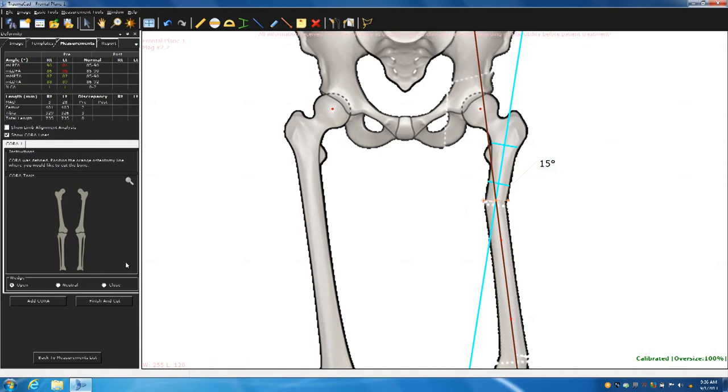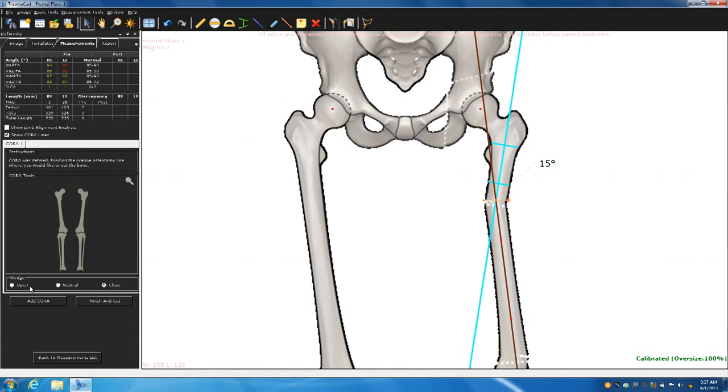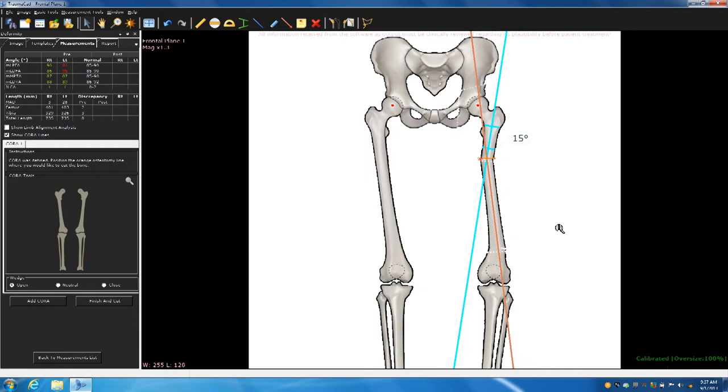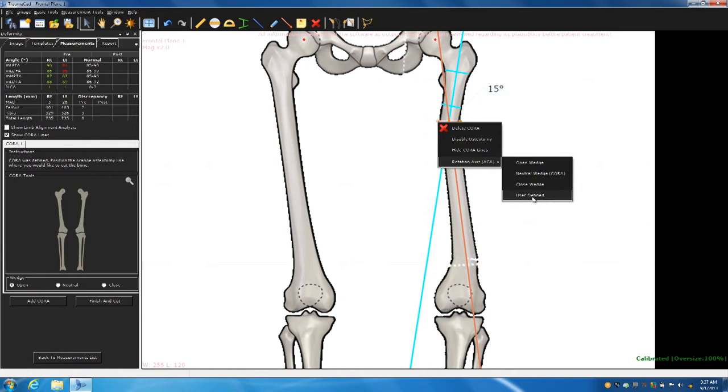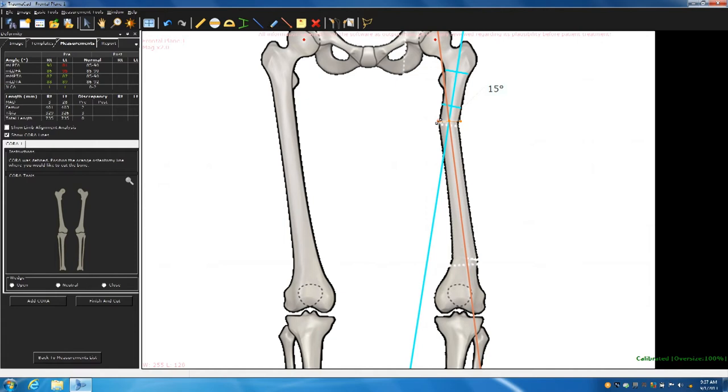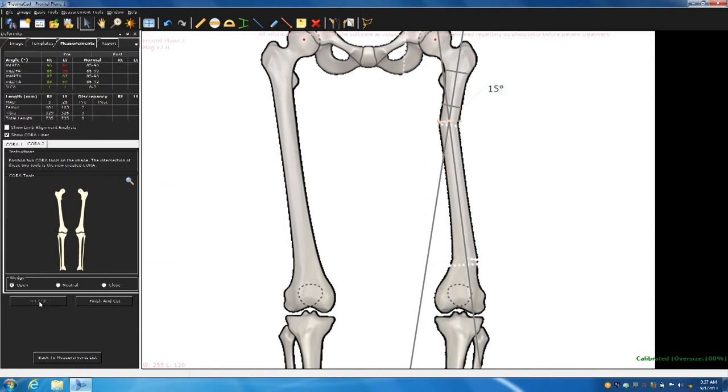You can go backwards. I want to recreate. I need a middle segment. To do the middle segment in a workbook, you just draw another line. In this program, you have to go back a step, get rid of your distal axis. You come up here to the undo button, and you will click it a couple times and wait until that goes away. And now choose your distal femoral axis for your proximal deformity. That's going to be in the middle of the bone. So you can choose a midline finder or a simple line. I'm going to choose a simple line. And then I'm going to adjust this line to be an anatomic axis in the middle segment. I'll zoom in. As you notice, as soon as your two lines cross, it creates an apex. It gives you a magnitude. It gives you an osteotomy site at the apex, which is really nice of them. And it also gives you a thumbtack, or this little red dot, mimicking your hinge. At this point, your hinge is set up for an opening wedge. If you look underneath your schematic, you'll see open, neutral, and close. If you hit your neutral wedge, you'll see that the little thumbtack jumps to the apex. If you click on closing, it jumps to the concavity of the deformity. Go ahead and keep it on open wedge.